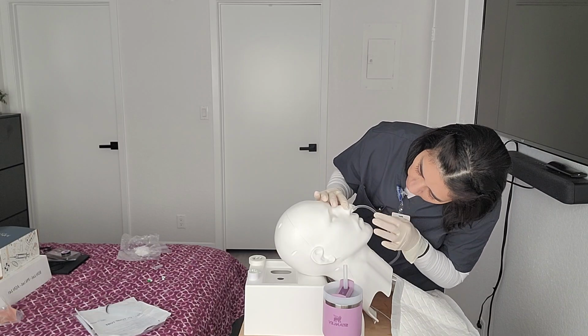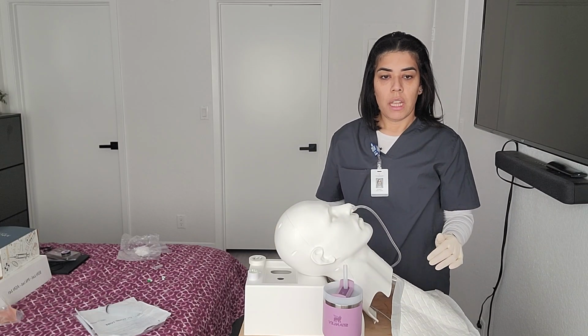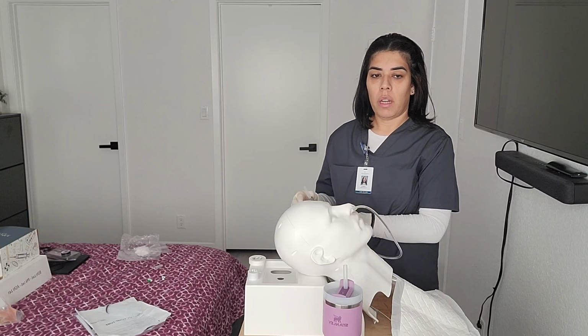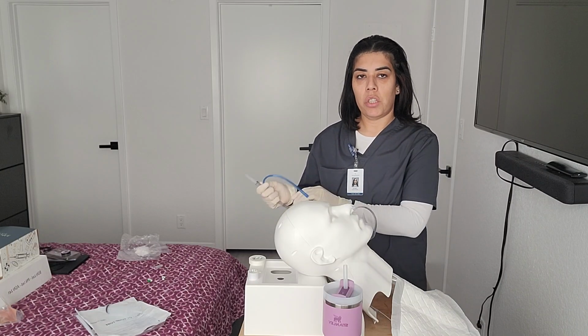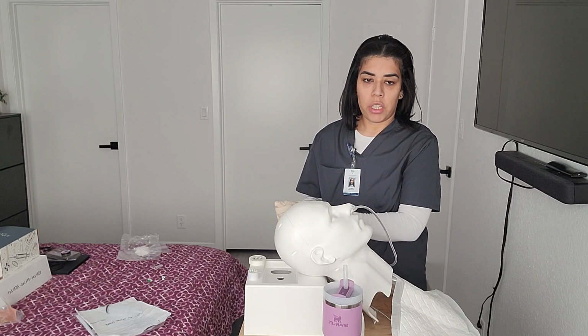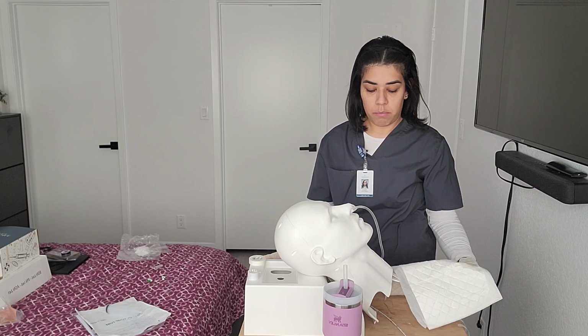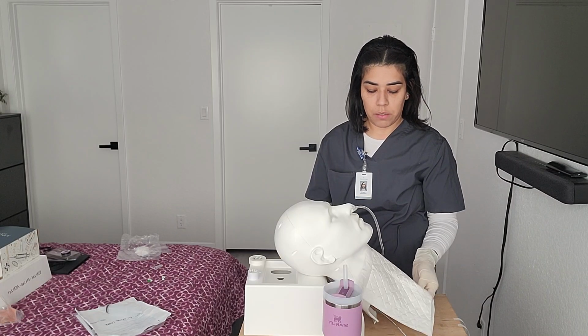And we're still at our mark point right there. Tube hasn't gone in any further. So now we're actually gonna go ahead and hook up the NG tube to the suction. And we're gonna check it every 2 hours just to make sure that the patient is not aspirating or anything like that.